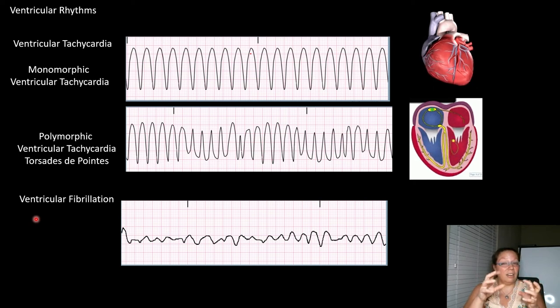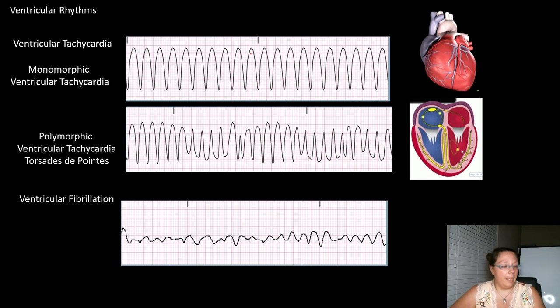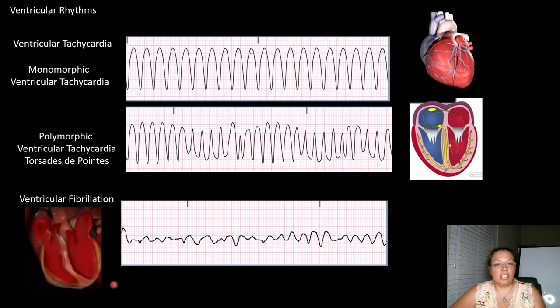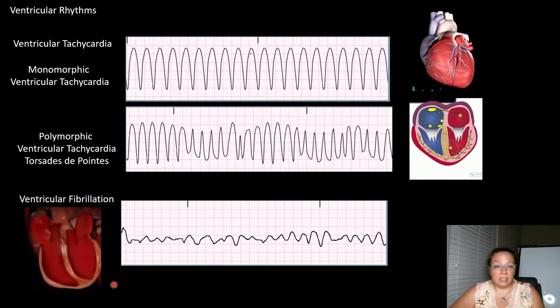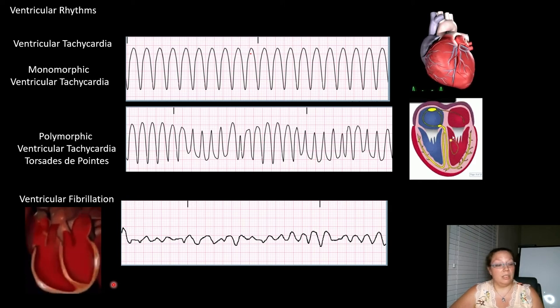If you don't get your heart out of the rhythm that's just making it quiver, then you're not having any blood flow to organs, to your brain, and that is what can cause death. So when you see V-fib, this rhythm right here, you want to think D-fib. Get those pads on that patient and shock them. What does the heart look like with this? Like that. See? It's just jiggling all over. It has no rhyme or reason. It's just wiggling. That heart needs a good slap across the face, get it back into motion, get it focused on its mission, and that is to pump blood to the rest of the body.